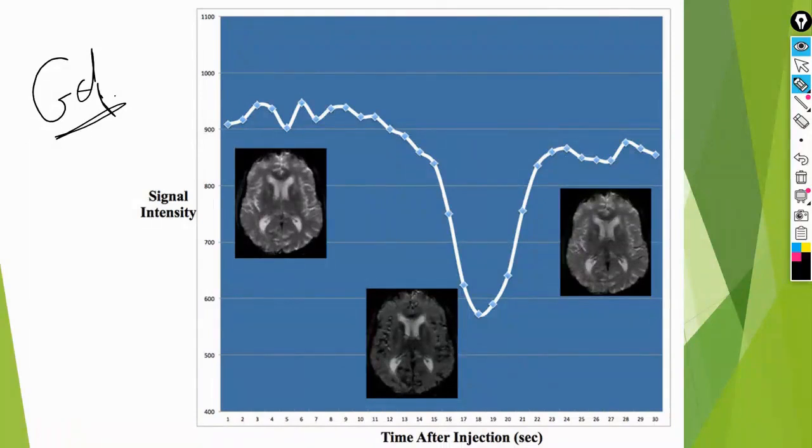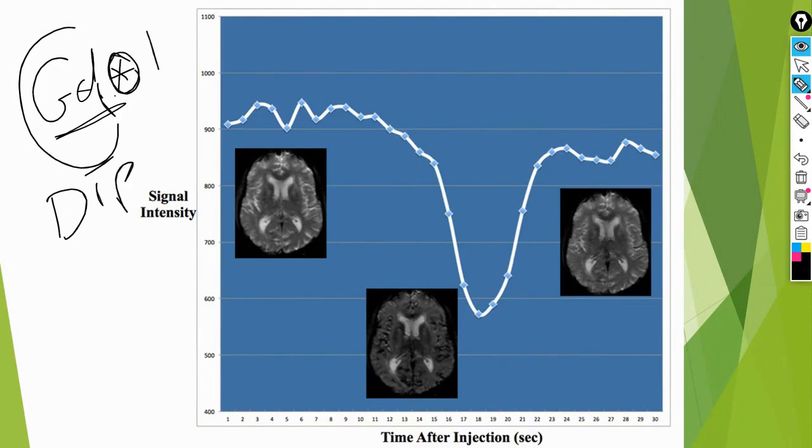Gadolinium is something you inject into the patient as a contrast agent that has free electrons, or has 7 binding sites, meaning 7 binding locations associated with an element called DTPA. There is an empty space here that binds with hydrogen. What this space does is it binds with it and changes its magnetic properties.